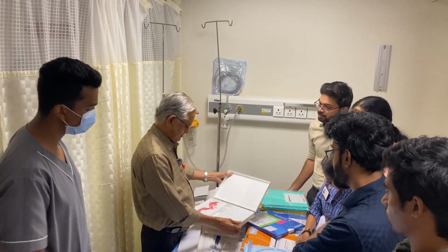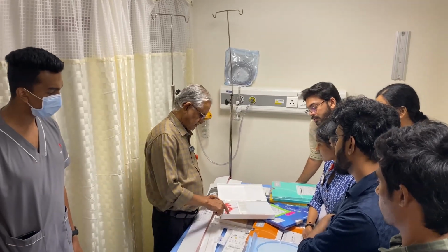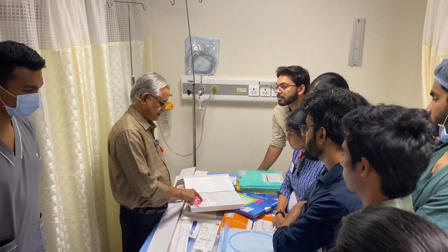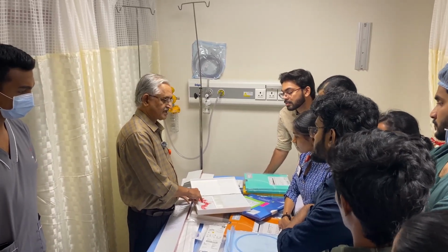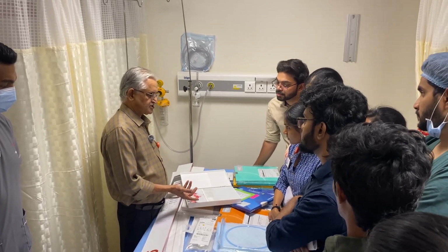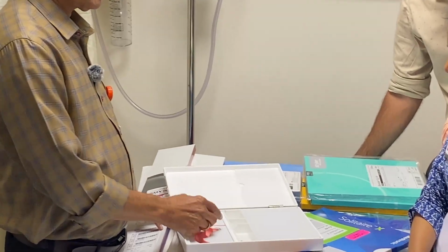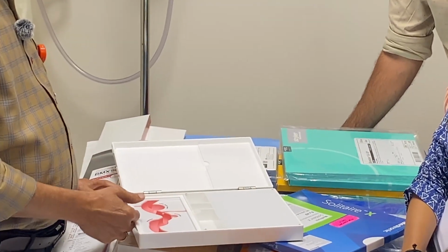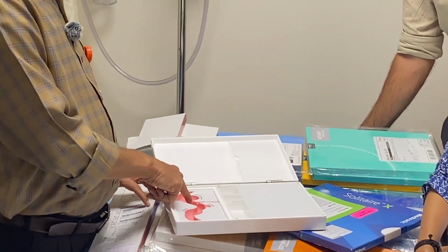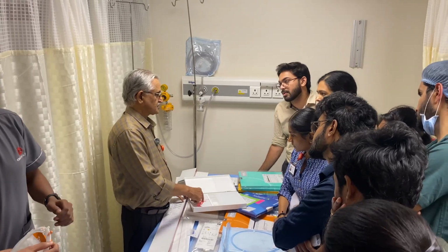There are 2-3 types of aneurysms. Aneurysms can have a narrow neck or a wide neck. Depending on the size of the aneurysm and the neck size, you'll have to decide on the type of device which you have to use. In a narrow neck aneurysm, it is safer to put coils, because the coils will remain inside and not come out. Whereas in a wide neck aneurysm, you cannot put a coil there because it will not be stable, so you have to use a flow diverter.